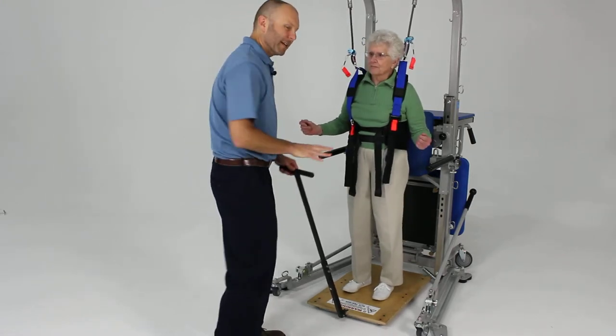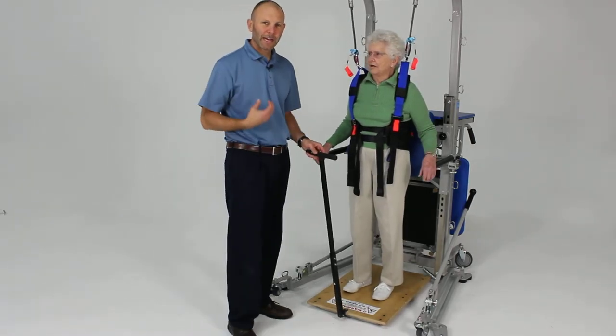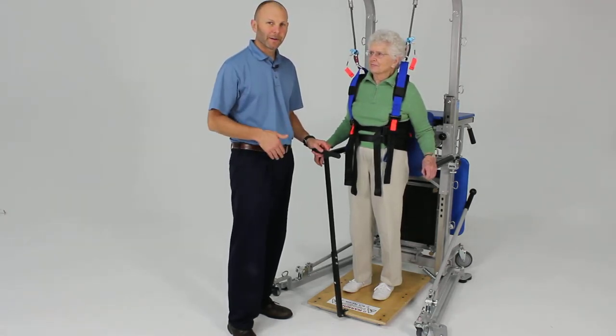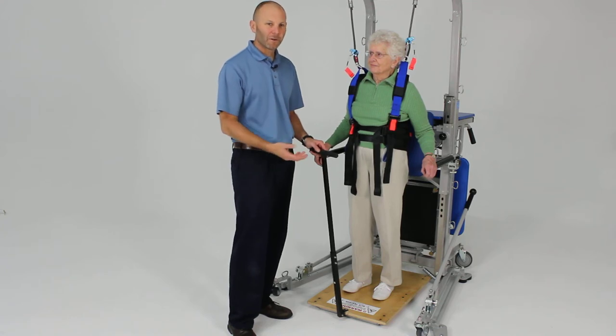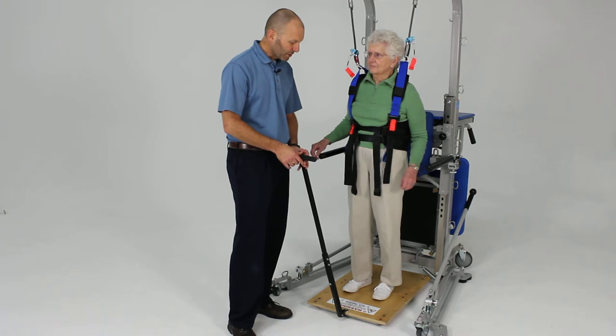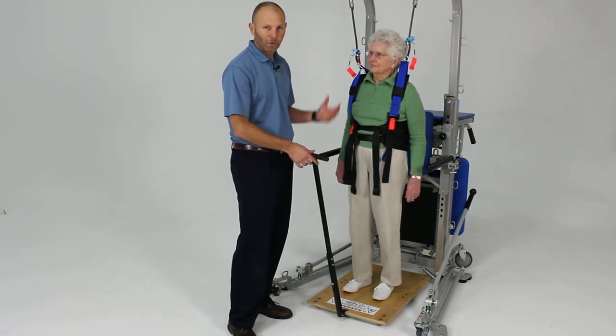It doesn't take much to induce those natural reflexive posture reactions that a lot of people don't work on until it's too late. When they're actually in the midst of a fall and they don't have those reactions appropriately, then they're in trouble. So this is just a way to start to do that in a safe, controlled environment.